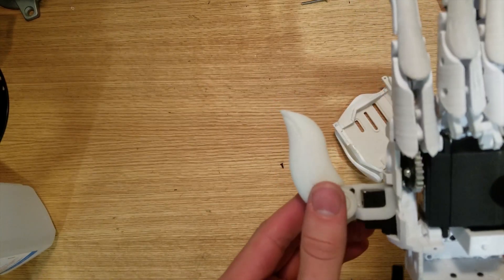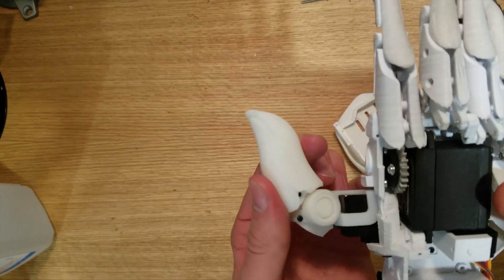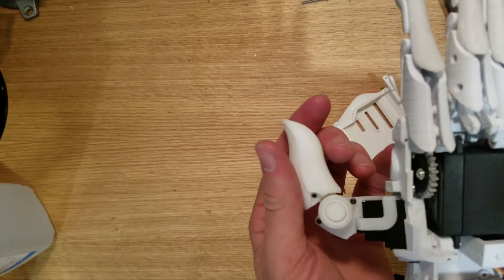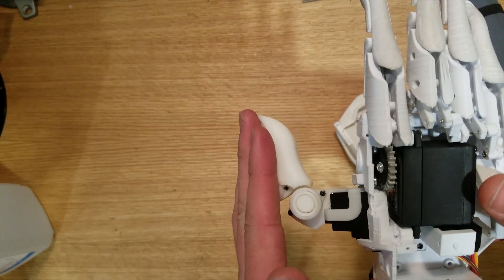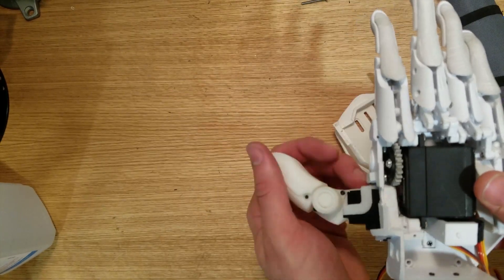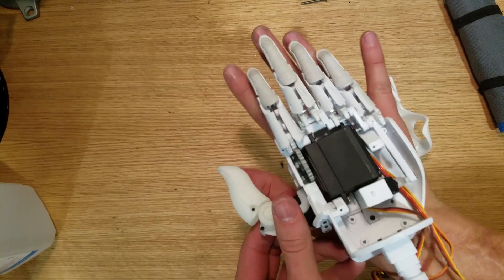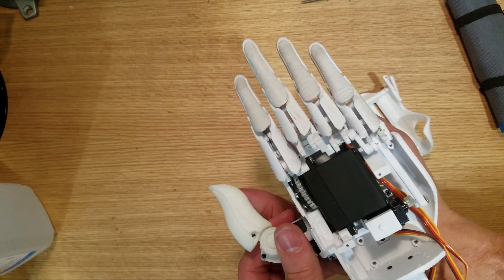I can also show you some more of the motion of the thumb. The thumb is gonna go back and forth like this, and it will also have a spring in here so that its natural state will be to be held closed, but then it'll open up as the person uses it to press against something. And here's another size comparison — my hand is just a little bit bigger than this hand. Of course it can't spread its fingers like this but it can go up and down.